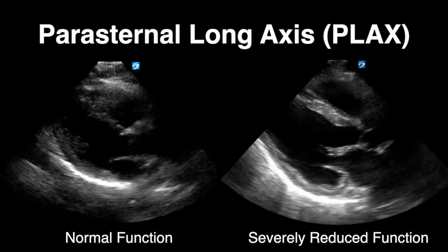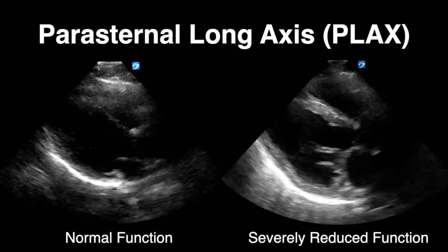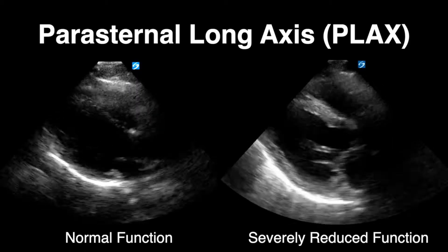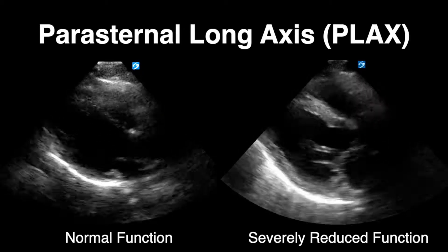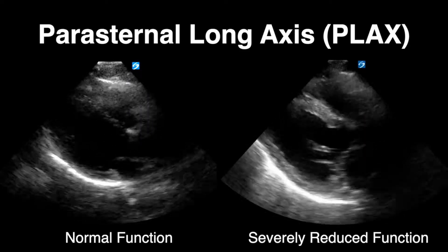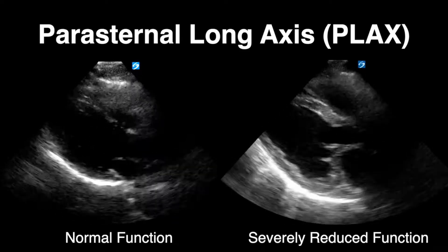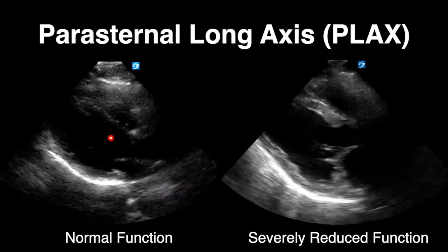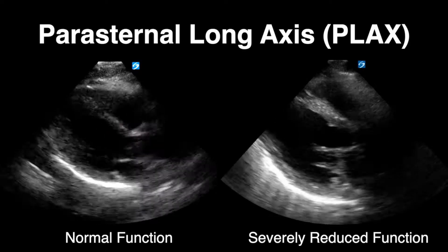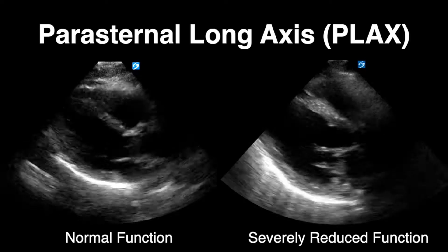Looking at normal cardiac function versus severely reduced side by side: in normal function the myocardial walls of the left ventricle are almost kissing. In the severely reduced EF those walls are barely moving toward each other. The mitral valve in the severely reduced image is just barely opening, whereas in the normal image you can see the mitral valve leaflet flipping up and hitting close to the septum. You also see the atrial kick filling the left ventricle.